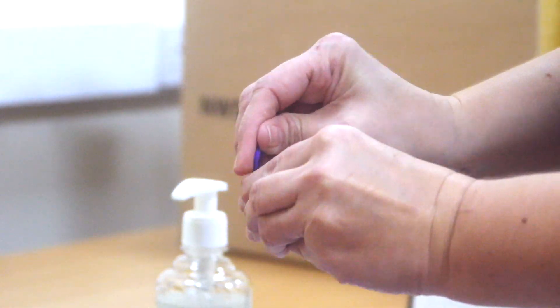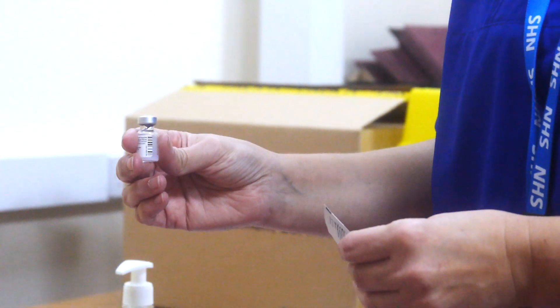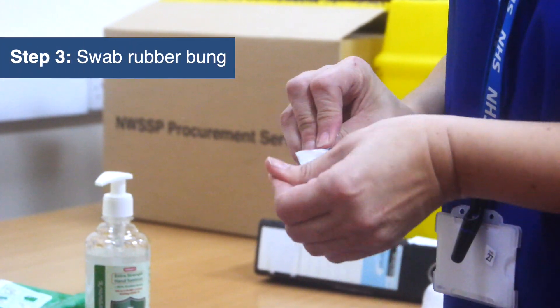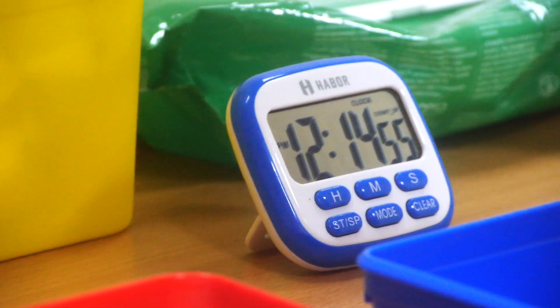You can now remove the sealing top and dispose of that. Because the vaccine doesn't have any preservatives, you need to be very careful with your ANTT. So we need to use a 70% alcohol swab and swab the top of the rubber bung for 15 seconds. I'm using a timer here.